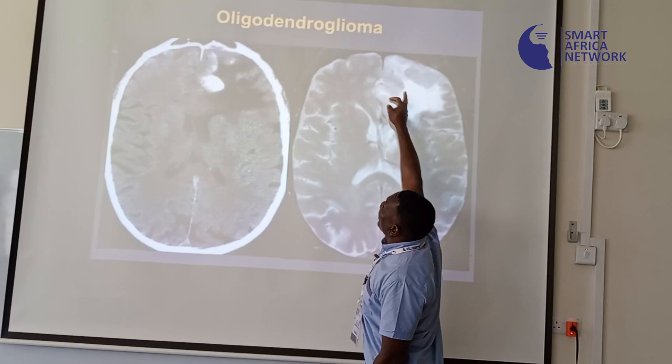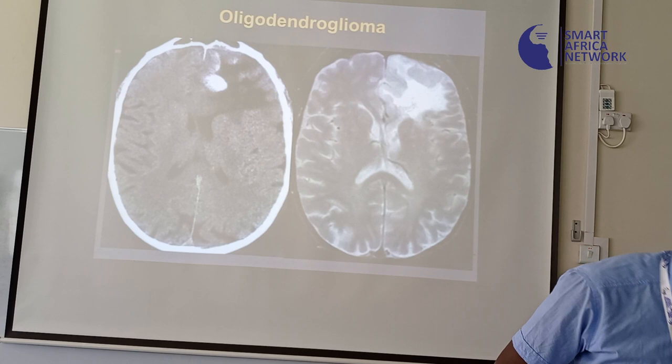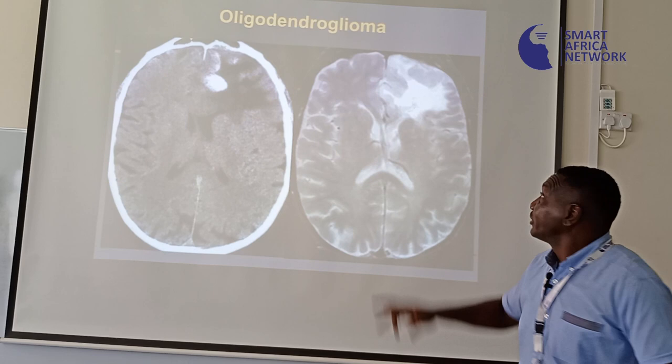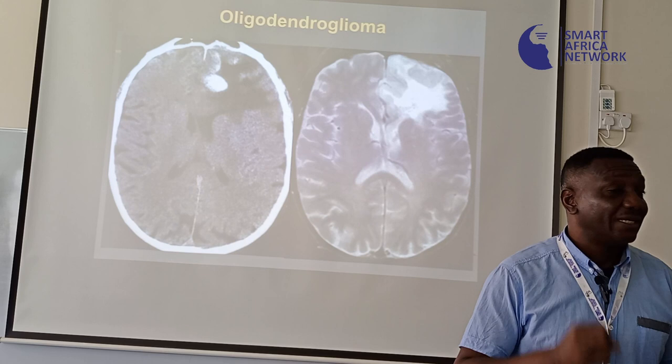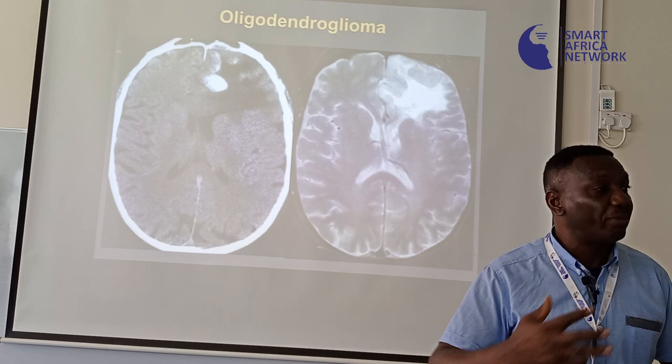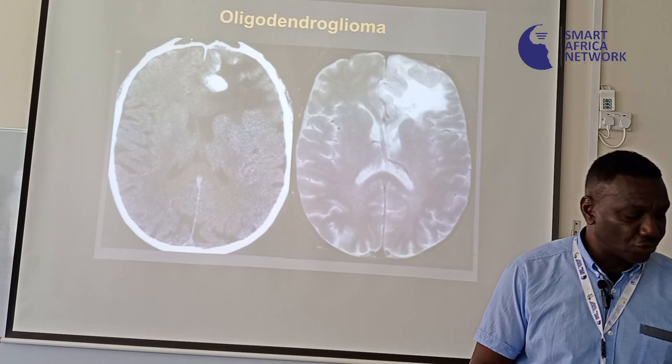And this is the case for the tumor that usually has calcific tendencies. Because we cannot make out what is on this side, we usually do what? We do a previous CT and we can actually characterize that this is a tumor, but it has calcification within it. And most likely, 90% of oligodendrogliomas, they calcify. So we can easily put the two together. So CT or MRI sometimes work, they are complementary tests. In itself. But in terms of soft tissue demonstration, the MRI stands out. Okay?